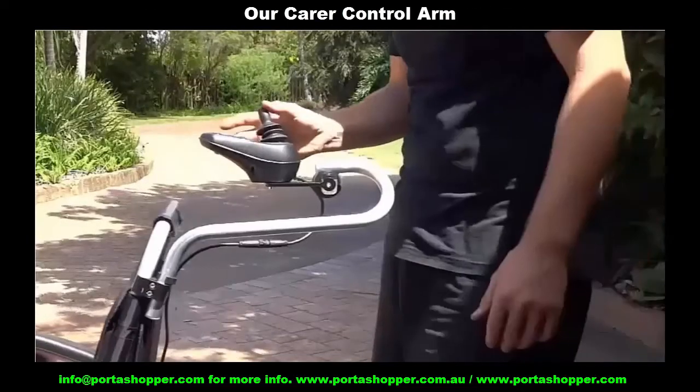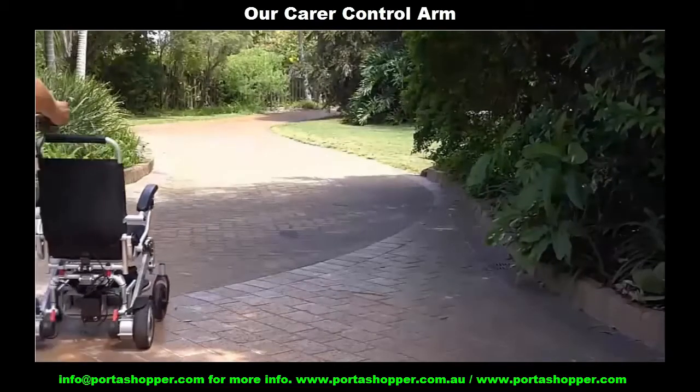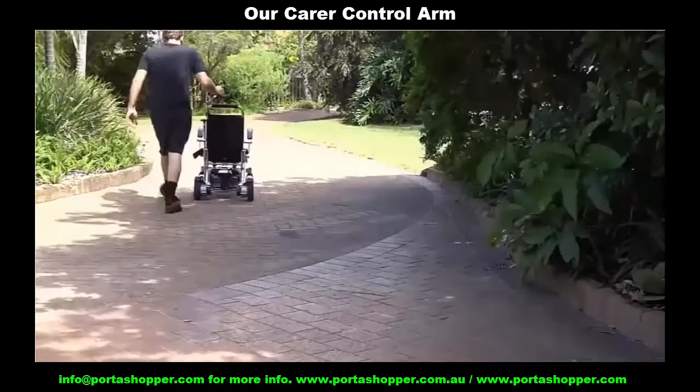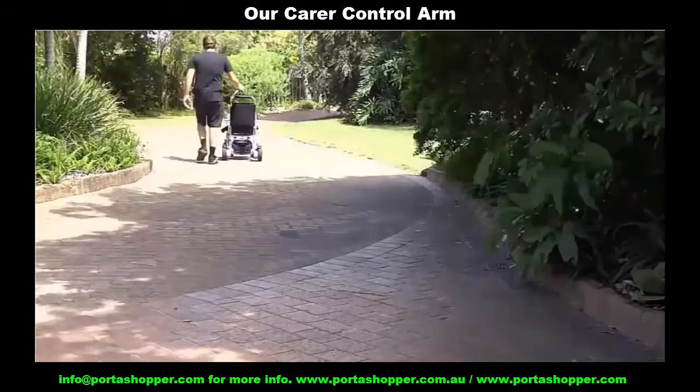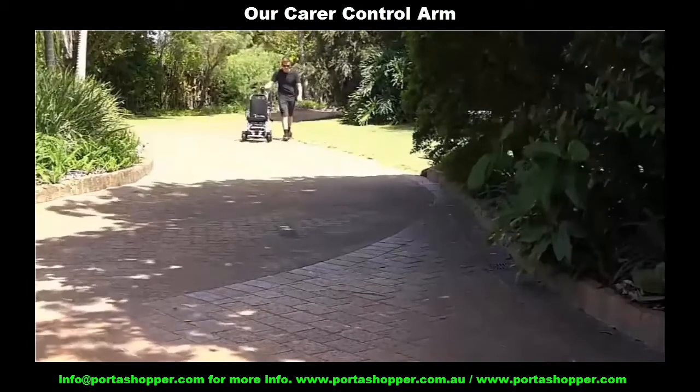If you battle with dexterity and you don't have enough touch sensitivity control to steer yourself with a joystick, have you found a model that ships with an easily attachable carer control arm so your caregiver can easily control and steer your wheelchair whilst comfortably walking behind it?